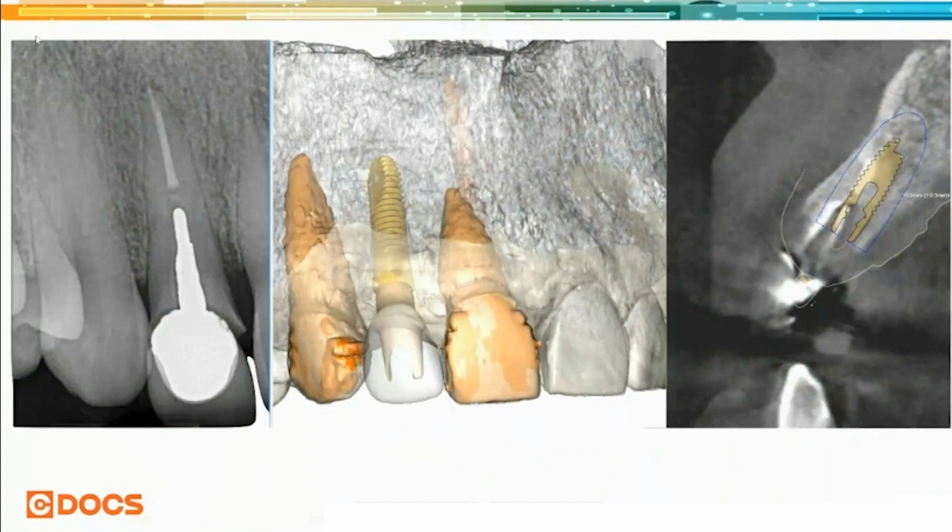everything. They've mapped the nerve. You make sure the placement is where you want it. If you want to make adjustments, it's as simple as making a note to Atlantis saying, I'd like it to be another millimeter in depth, subcrestally, whatever that looks like. You can also use the software and move it yourself if you want to.